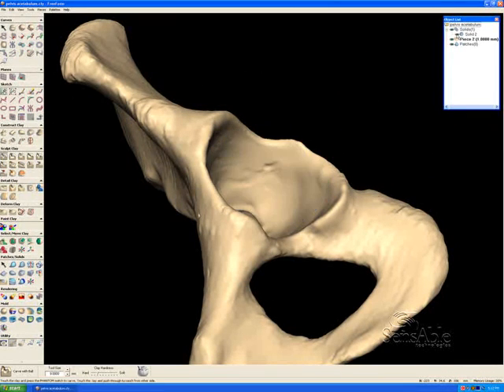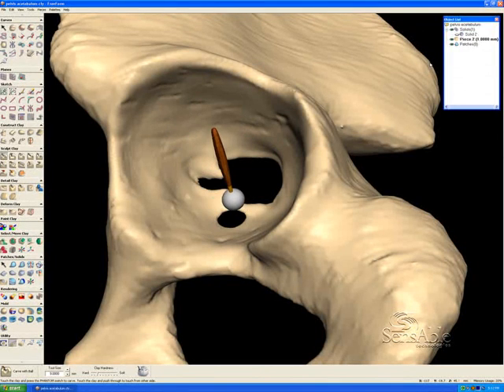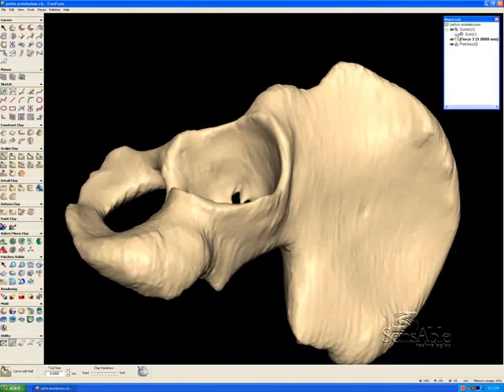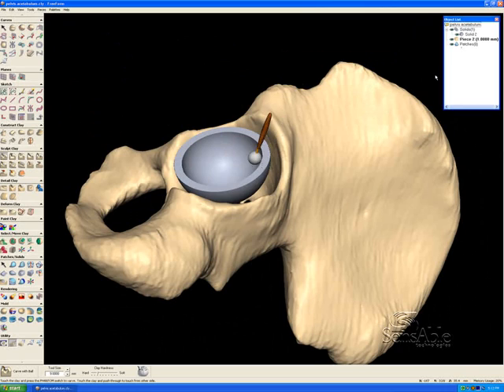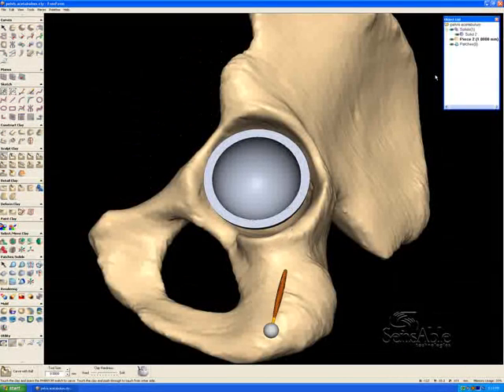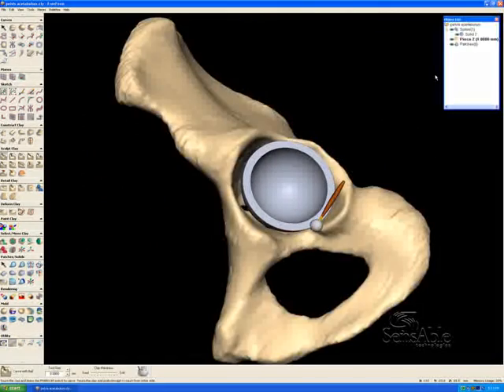I'll hide the parasolid here in the object list for a second to show you the injury to the patient's pelvis here. This section, this pocket called the acetabulum, is corroded and needs an implant. That cup is the implant. The use of Freeform here is going to be in constructing tabs that come off of the edge of this cup and mesh perfectly with the scanned data, the bone of the pelvis of this patient.